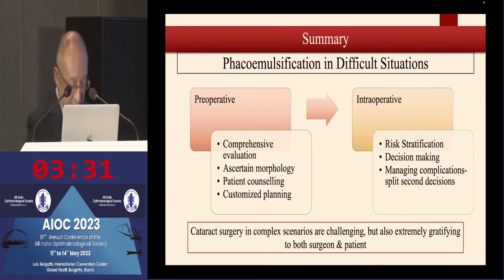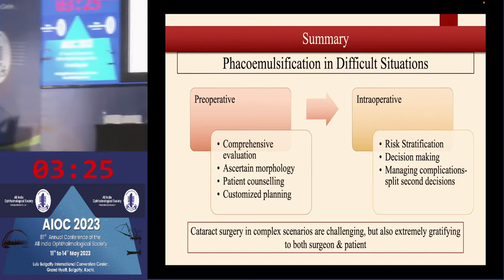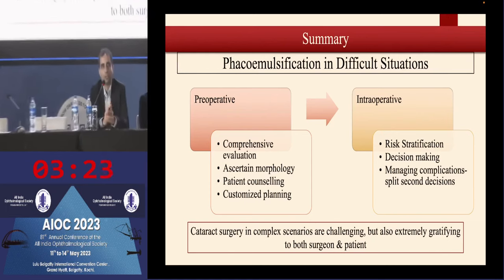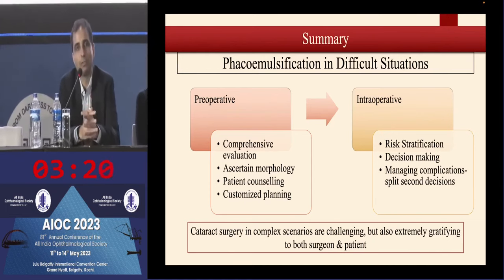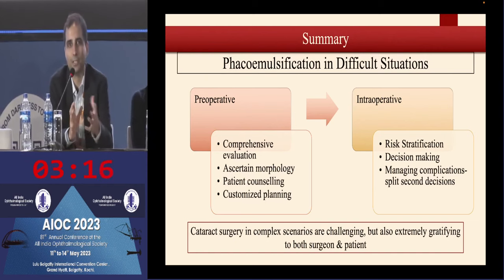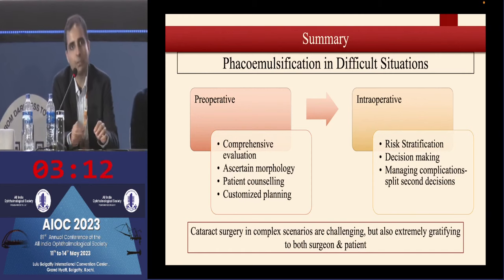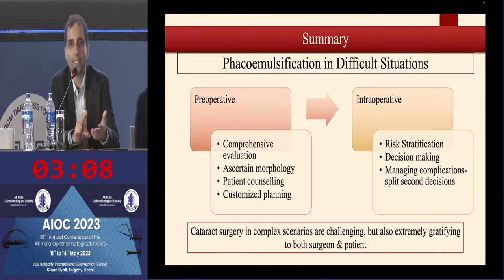Subin? I think, like sir correctly mentioned, if you have a regular topography in the central mesopic pupil of the patient, say the mesopic pupil is 3 millimeters, 3.5, which is common in our population, our mesopic pupils are not very large, and if in that mesopic pupil zone you have regular astigmatism, bow tie, those are the cases where you can definitely consider a toric, even if it is post RK or post LASIK.